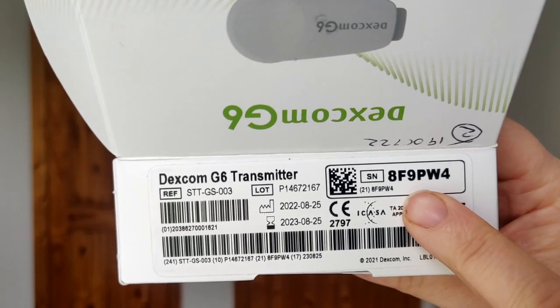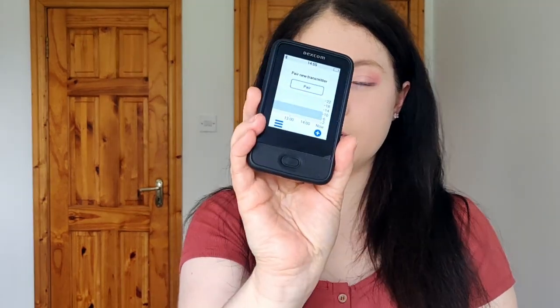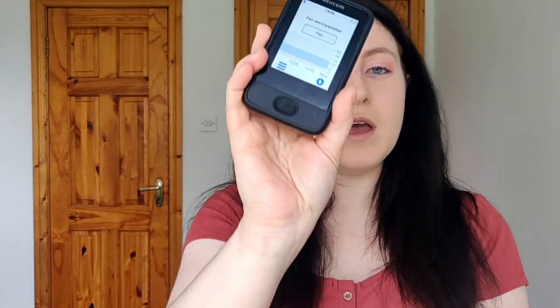The most important thing is the number for the transmitter — this is the code we're going to use to activate it. To pair your new transmitter you can do it on the receiver, which I like to use, or on the mobile app. I'm going to do it on the receiver first and then also pair it on the mobile app later so you can see both.